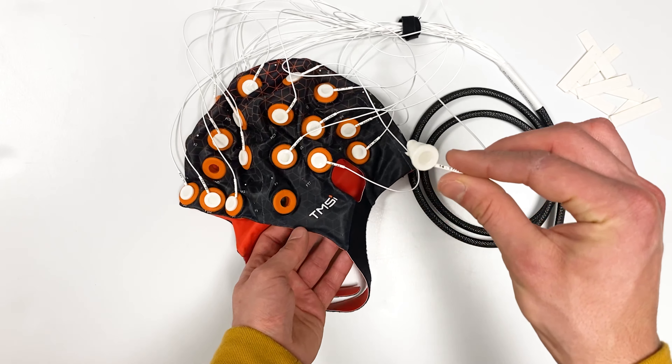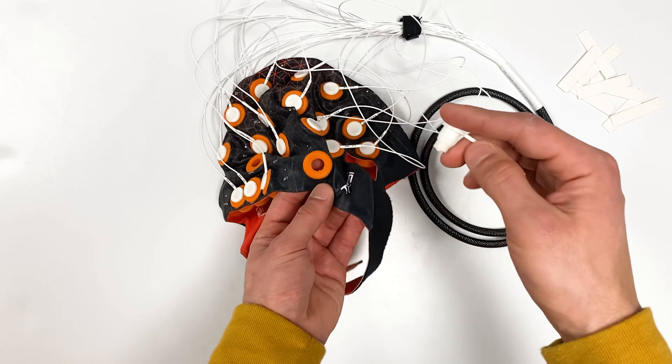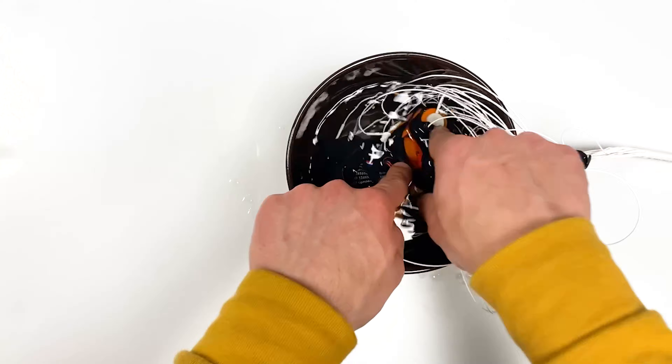Next, place the water electrode in the cap. Make sure to pay attention to the labeling of each electrode and its location on the cap.